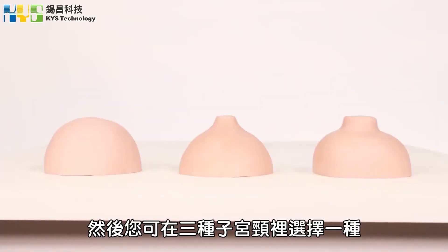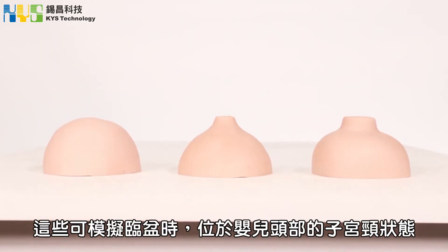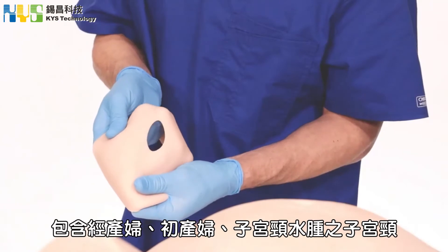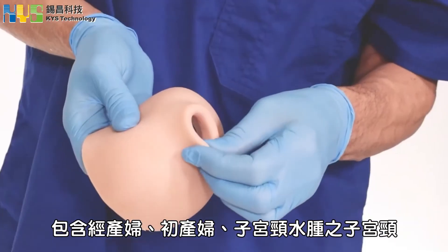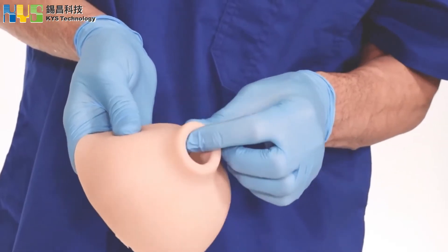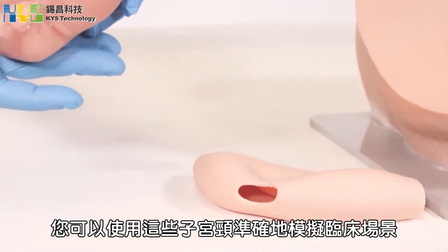You can then choose one of the three types of cervix. These represent the cervix on a baby's head when the birth is imminent. There is a multipara cervix, a primipara cervix, and an oedematous cervix. You are able to accurately simulate scenarios using these cervixes.